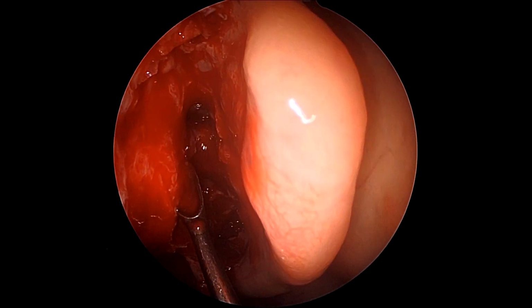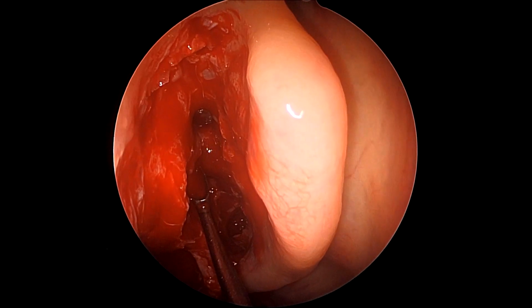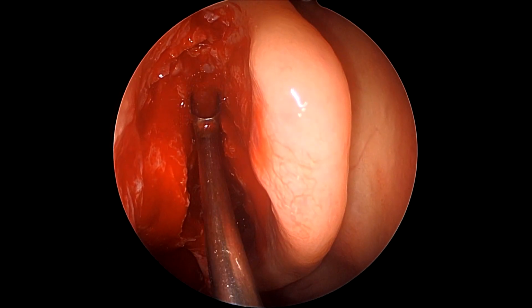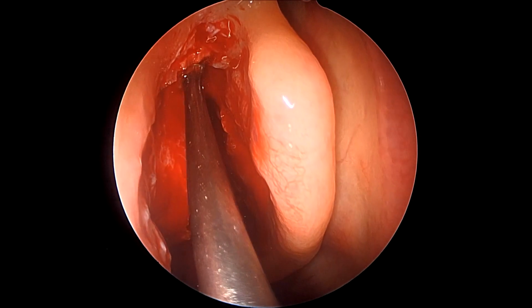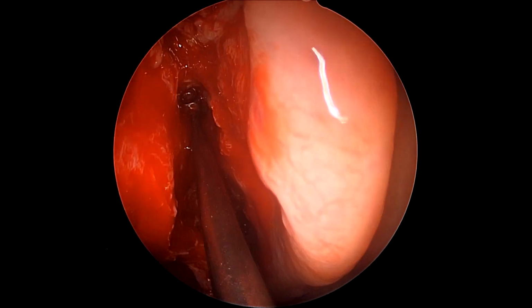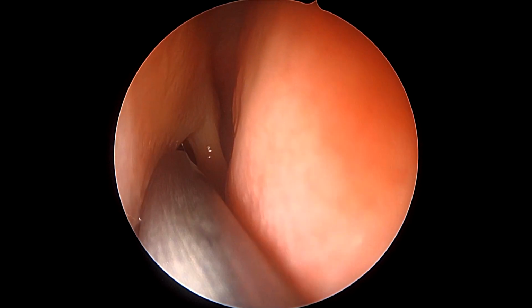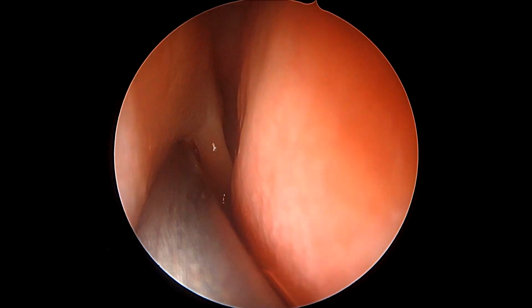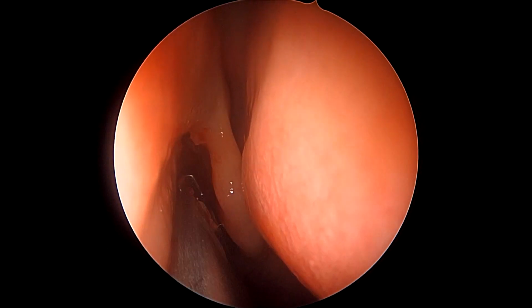That is the lamina papyracea. Some bit of anterior ethmoidal bone may still be there, which can be removed, but most of it is lamina papyracea. That ought to be our lateral boundary of dissection. So opening the sphenoid obviously gives us a good boundary. We know our posterior boundary, inferior boundary, lateral boundary being the lamina papyracea, and medial being the middle turbinate.